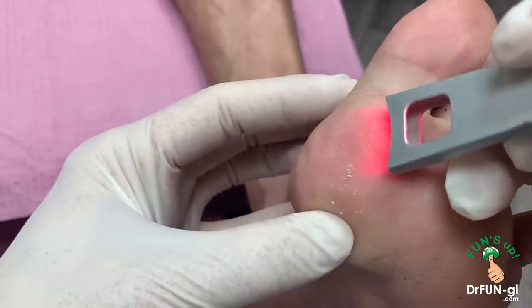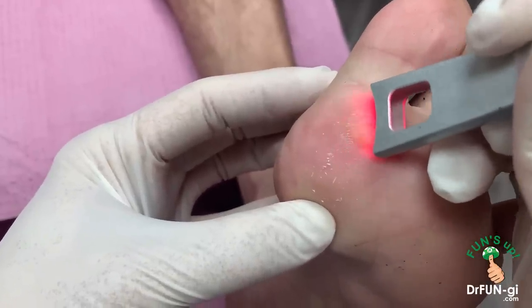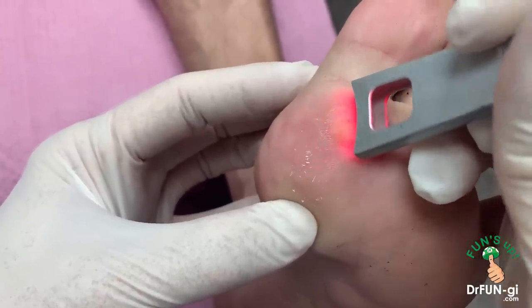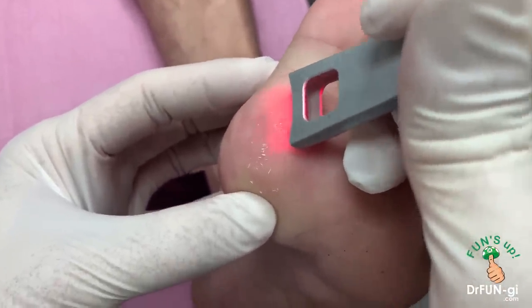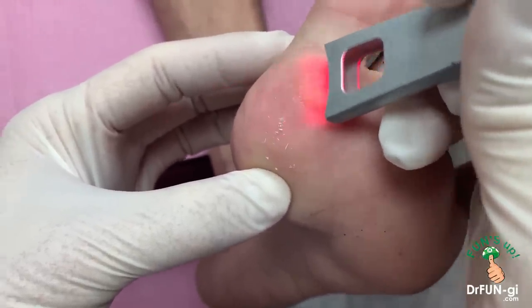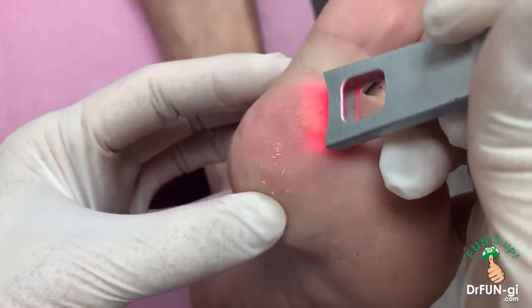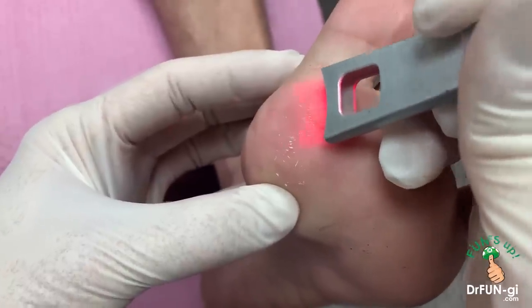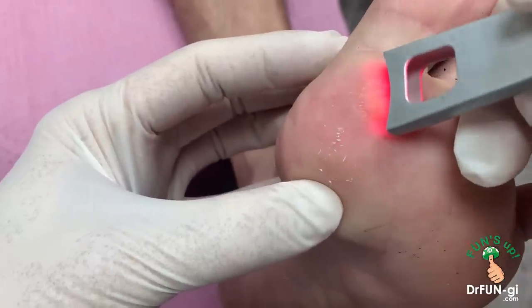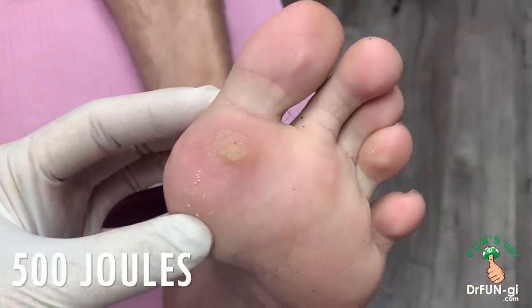So I'm looking at how much energy I'm putting in — we're at about almost 400. It'll stop when I reach about 500 joules. So we're almost getting there. I know it's getting hot, but I don't want to hurt Jason too much. He has to go to work, right? Not working today — just tomorrow. So tomorrow if he has to work, he'll be thinking about me all day. So we're reaching almost 500 joules — there, that's 500 joules.